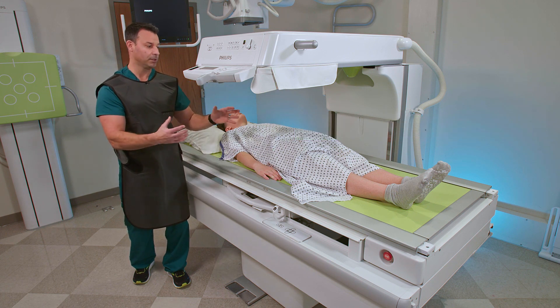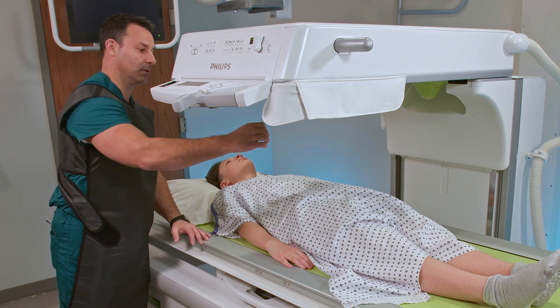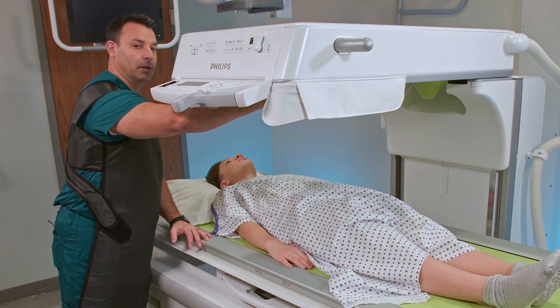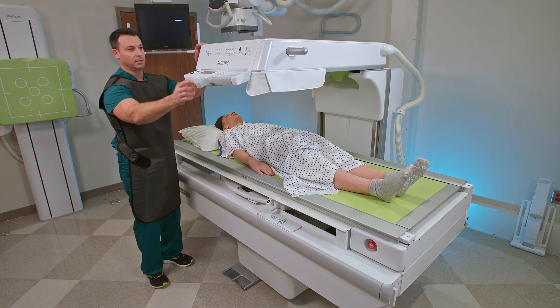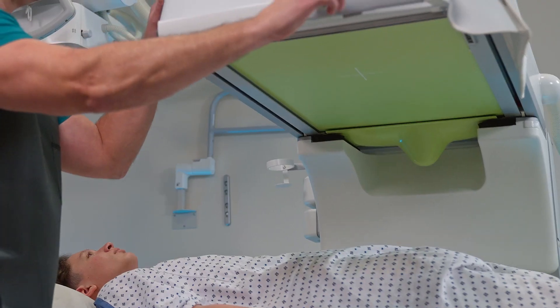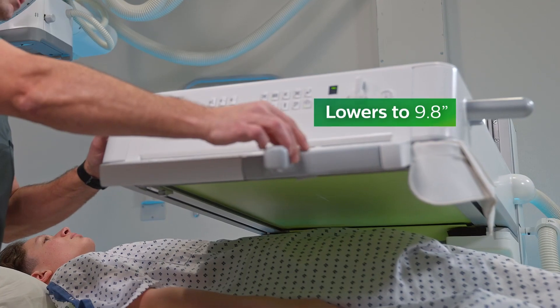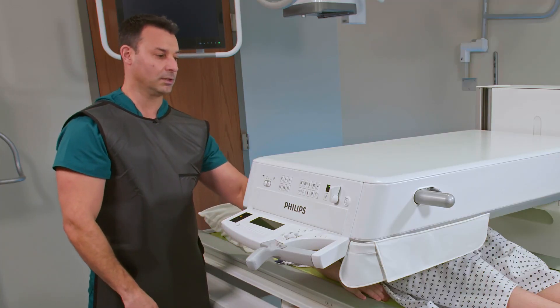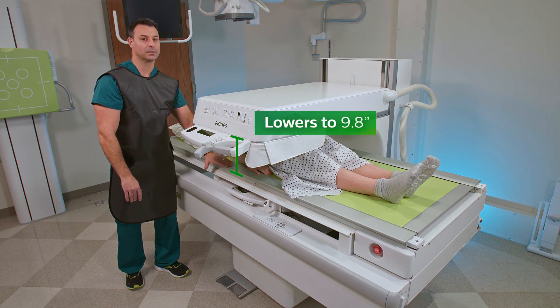So if you have really large patients and you're doing a lumbar myelogram, you have much more access to move the needle around the patient, and you don't have to worry about hitting the top of the tower. The other benefit is the tower goes down as low as 9.8 inches. For pediatrics, it's also good because you can get your tower closer to the patient, which reduces your object to image distance.